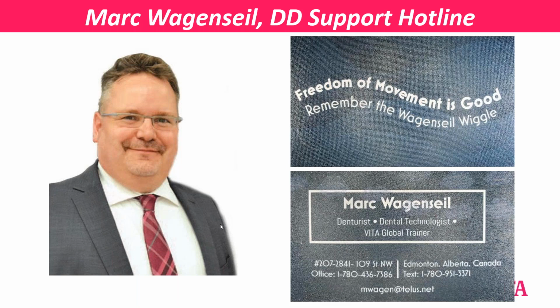Yes, absolutely. And with implants even more, because now what happens is, depending of course on the implant you use, you've taken it off the gum. So if it's on a bar, it's not even on the gum anymore. You've taken away that patient's perception of the hydraulics and how much it's squishing. Even if it's on a locator implant, it's controlling how much hydraulics are placed on there now. You're buggering with the central nervous system and their perception of what they've been feeling.